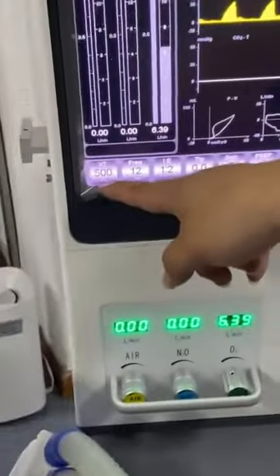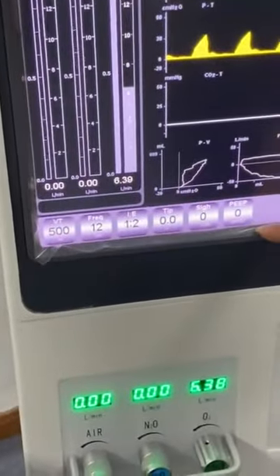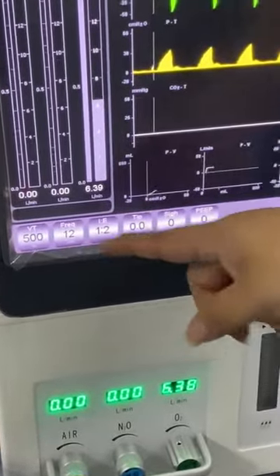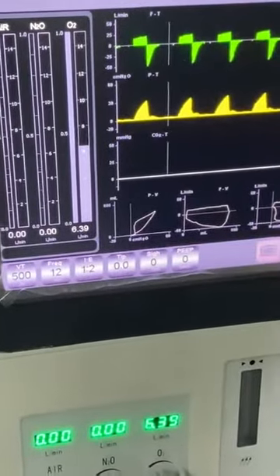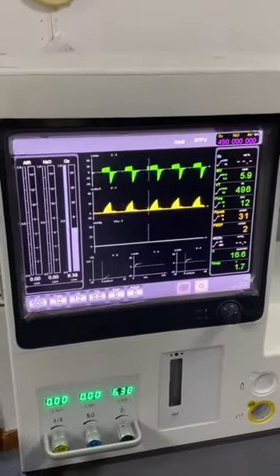And the last part is the bottom side. Here we can also see some parameters. These parameters are just what you have preset for the patient. So it's also for reminding the doctors to check if any setting is wrong. And the doctors can also check the adjusting parameters together with the monitoring parameters. So they will know if the patient is using the machine well or not.